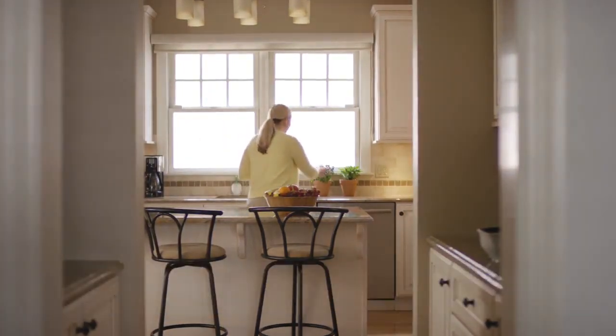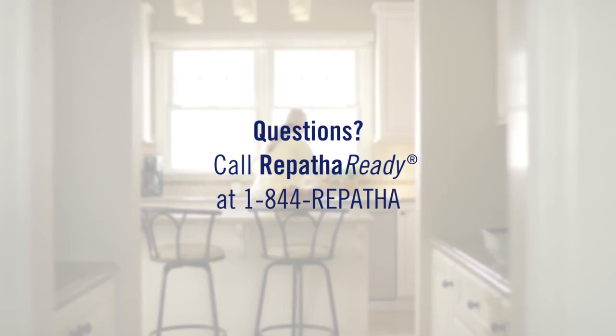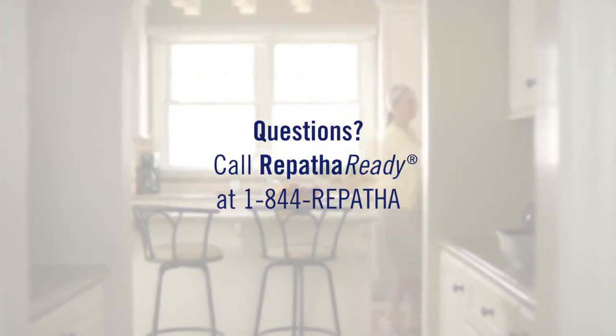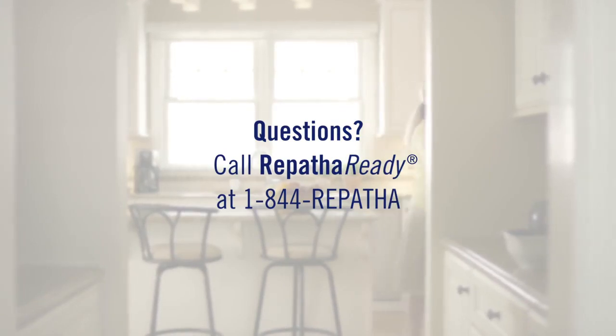You're all done. Remember, if you have any questions about injecting, read the instructions for use, or contact your doctor, nurse, or pharmacist, or call the nurses at Repatha Ready at 1-844-REPATHA.